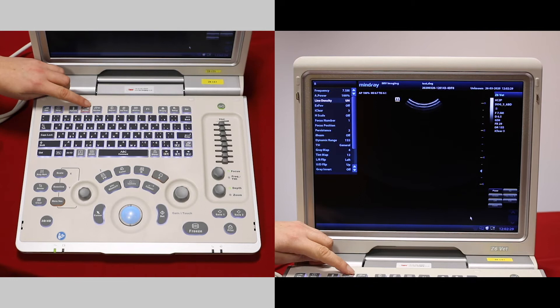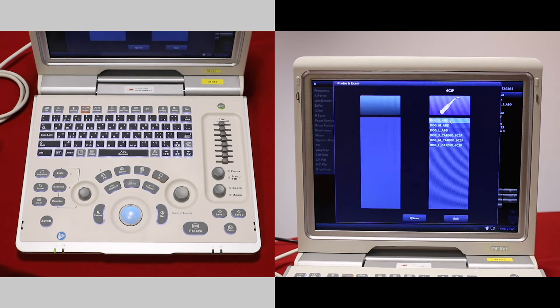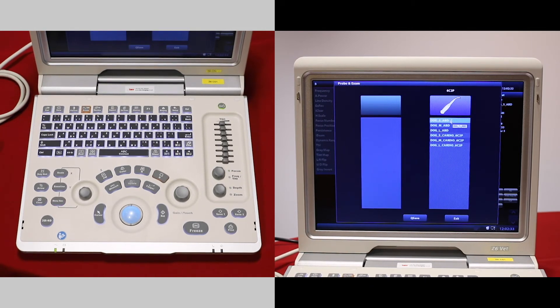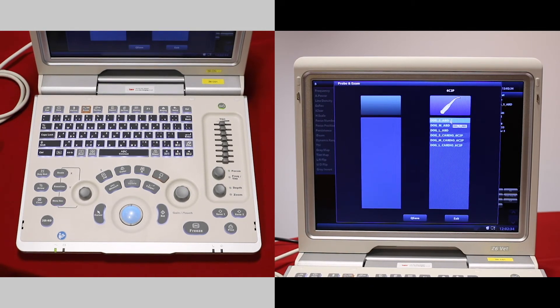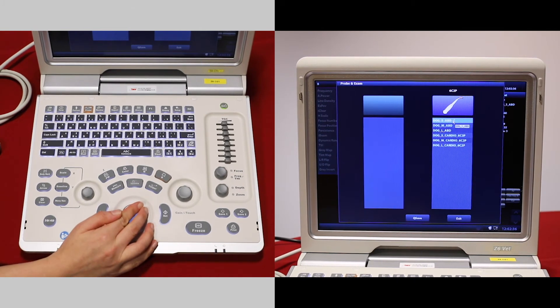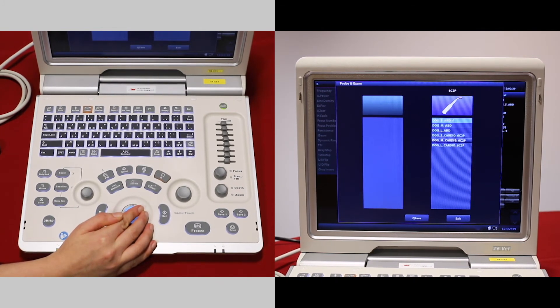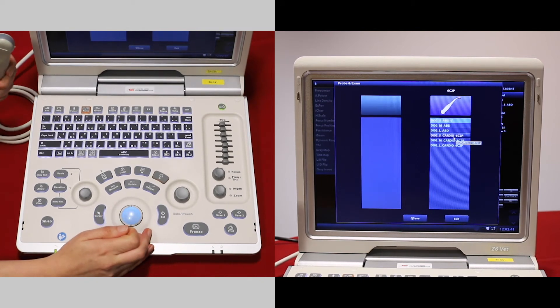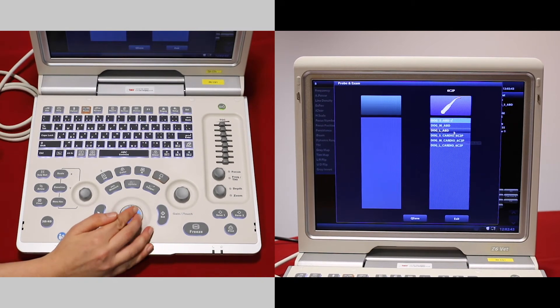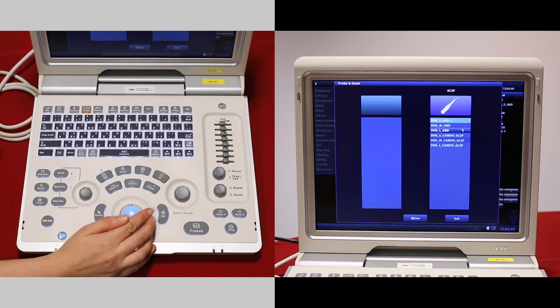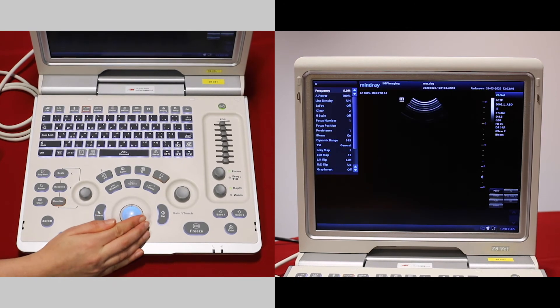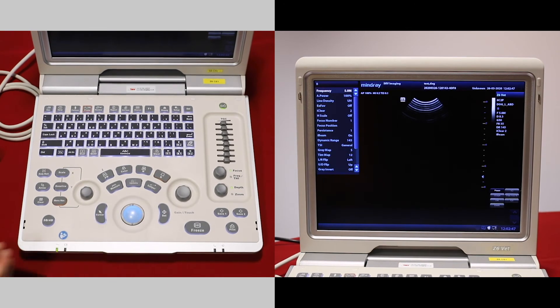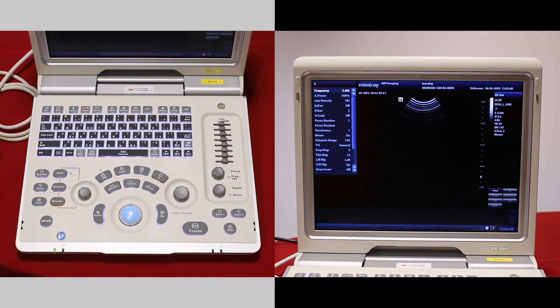The next button to press is probe, which is just beside patient. This is where our veterinary presets are kept. We've selected dog, so we've got dog abdomen and dog cardiac presets for this microconvex probe. Select the one which is most appropriate, and that's a good starting point for our scan.